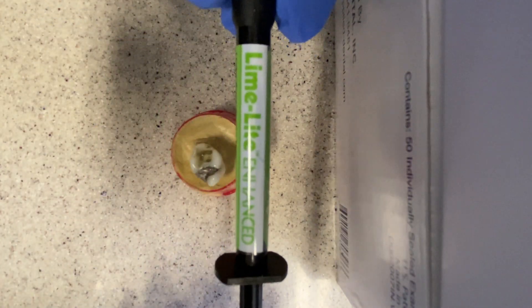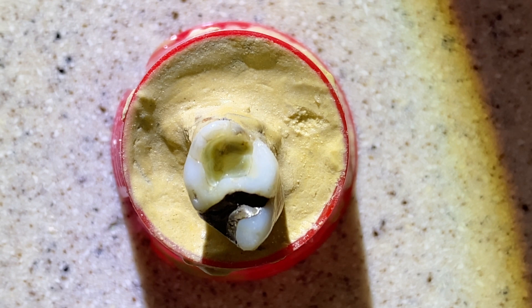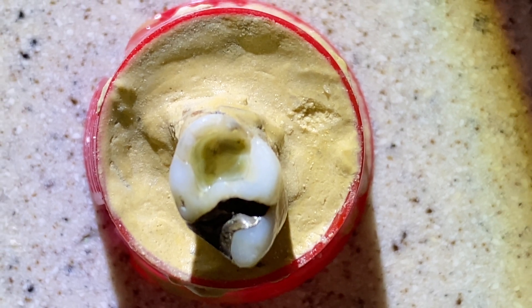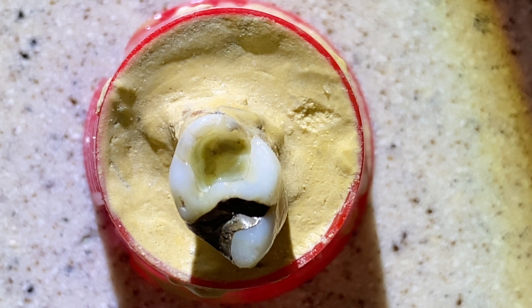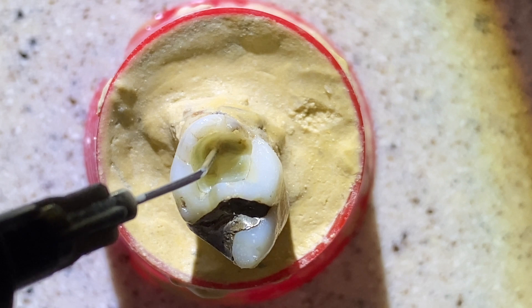All right, so here I'm going to show you this is the material that we're using — Limelight. When we have a situation like this, you can see I've drilled out an area and it is moderately deep, not extremely deep. So what we do is go ahead and place the Limelight into the preparation.